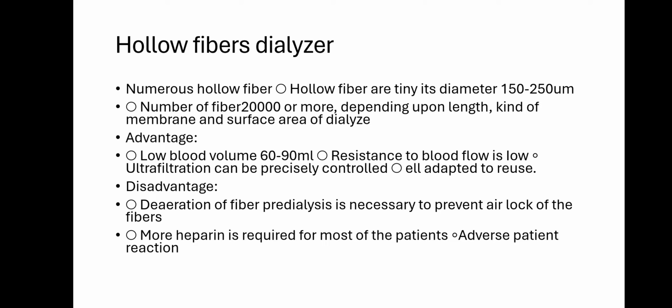The disadvantages of the hollow fiber dialyzer: pre-dialysis priming of the fibers is necessary to prevent airlock of the fibers, and more heparin is required for most patients. There can also be adverse patient reactions. These are the features of the hollow fiber dialyzer.